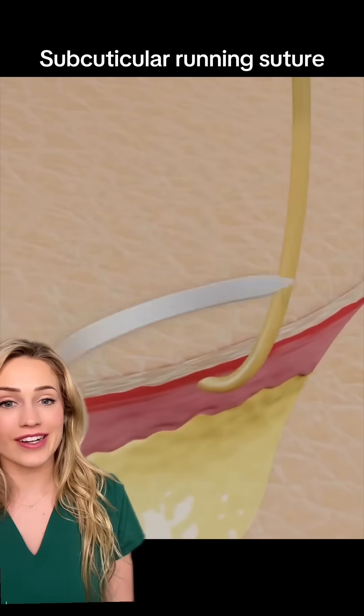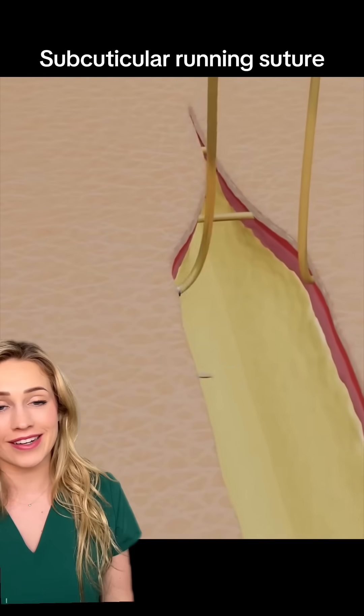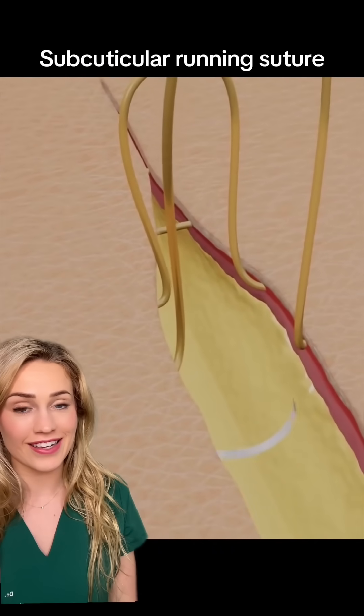They're taking the suture and going through not the epidermis but the dermal layer of the skin, going in a continuous fashion, and each pull brings the edges of the skin together.